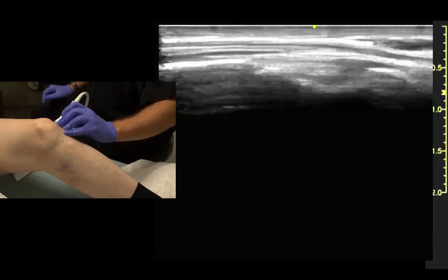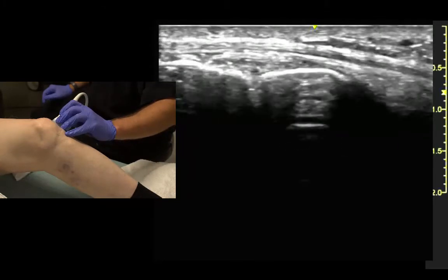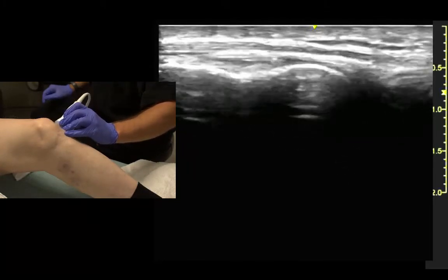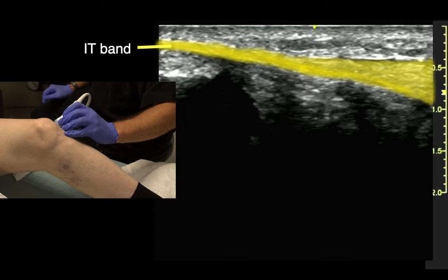We can follow it all the way proximal and distal. A little more anterior, this big tendon plays out — that's the iliotibial band.